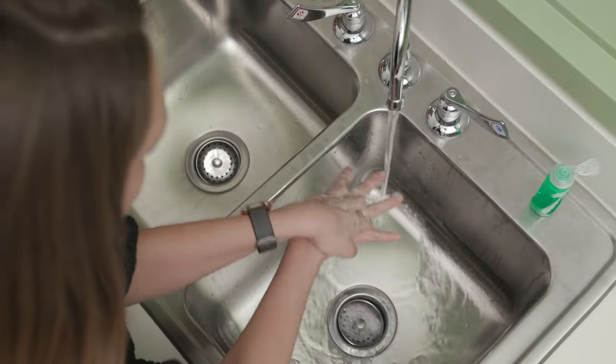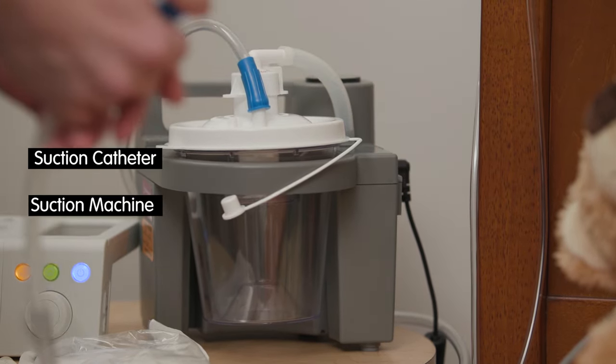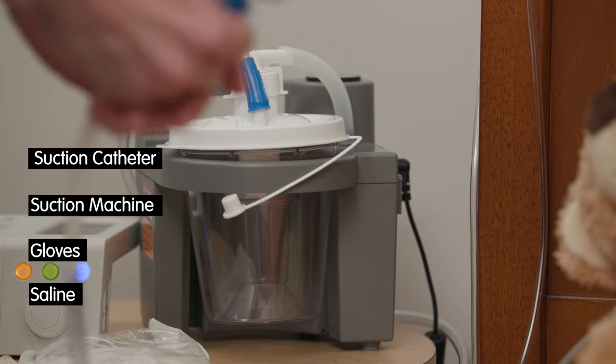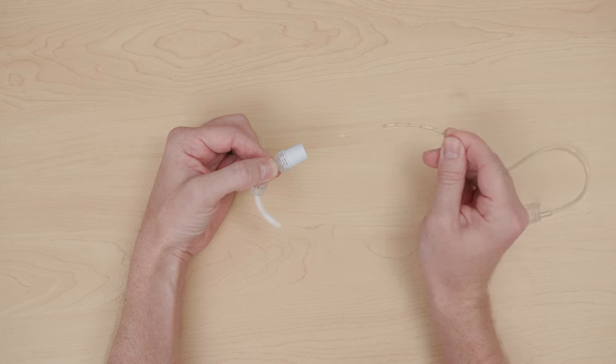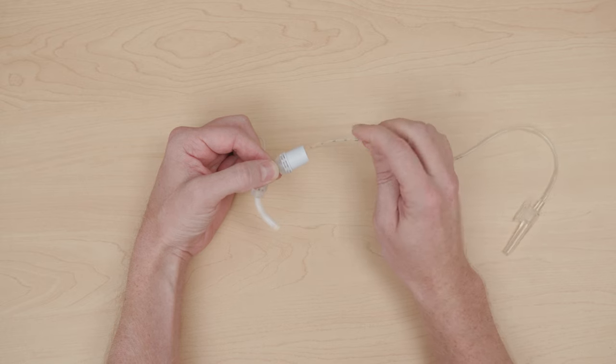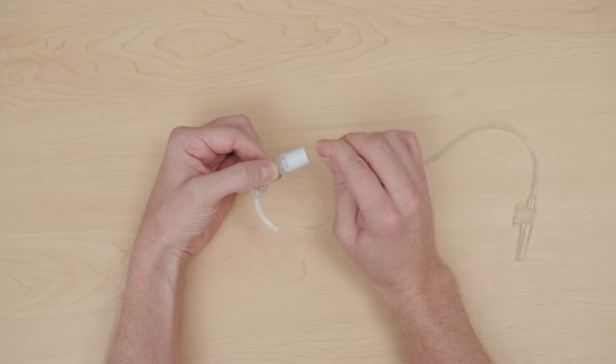Wash hands with soap and water or apply hand sanitizer for 20 seconds. You will need a suction catheter, suction machine, gloves or clean hands, and saline. When choosing an open suction catheter size, choose the largest catheter that fits inside the trach. This allows maximum clearance of the secretions.